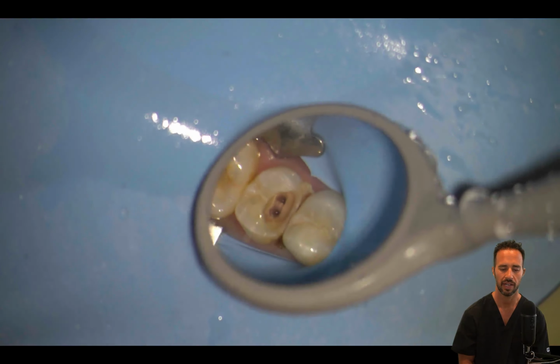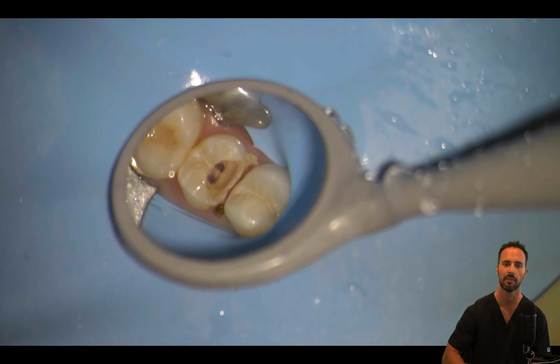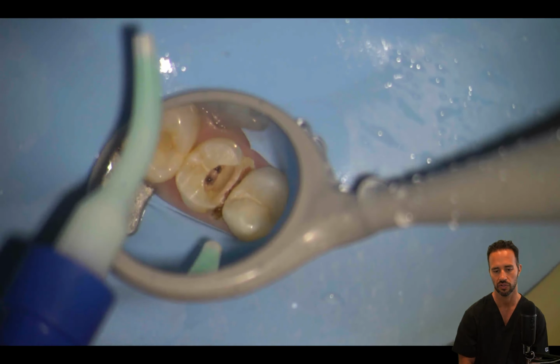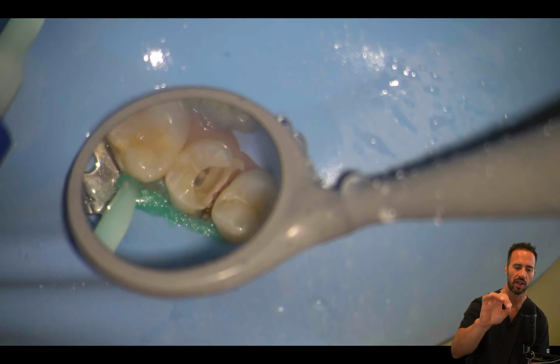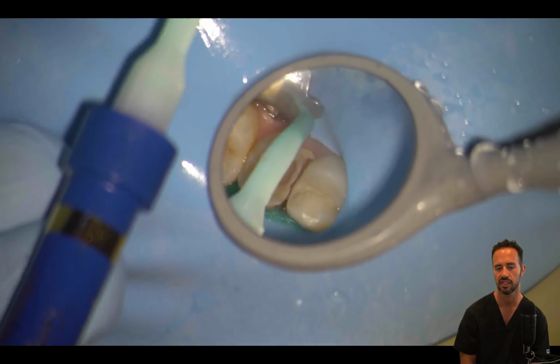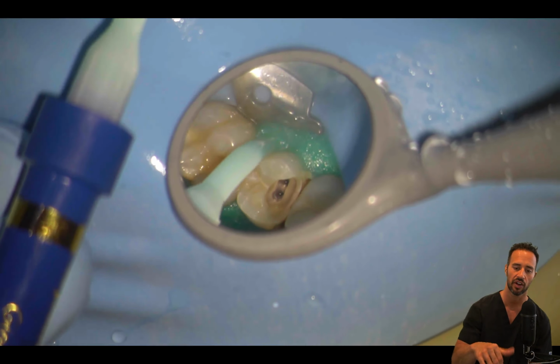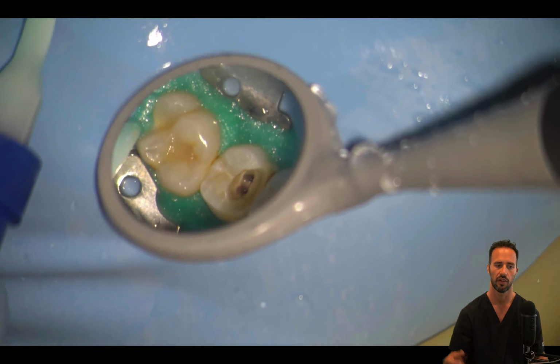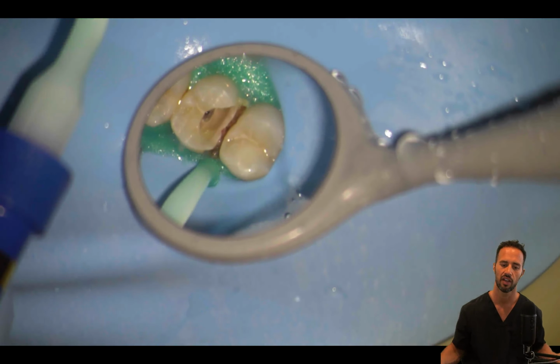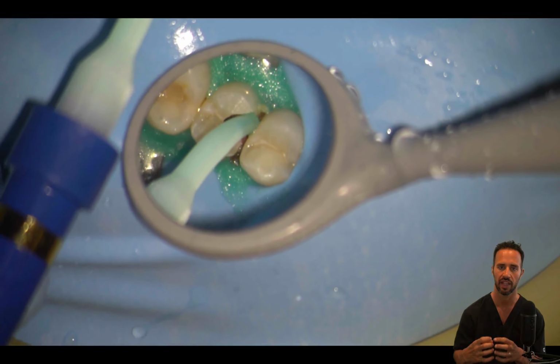So coming up now, we're going to start with the application of the Opal Dam Green material by Ultradent. And you can see that there, and it's just going to be squirted around any area where you can see soft tissue or gingival tissue. That's going to be a potential ingress point for your sodium hypochlorite and a possible point of contamination from the saliva wanting to seep its way up. Okay, we want a really, really airtight seal.